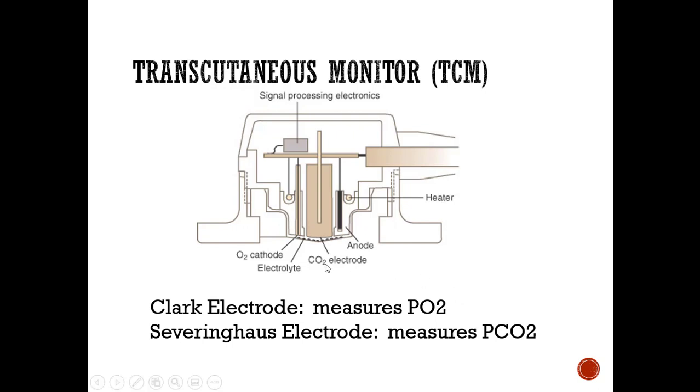So this definitely should make it on a flashcard. Clark electrode measures PO2. Severinghaus electrode measures PCO2. This is a good board question and definitely comes up on an exam. So this should be on a flashcard.